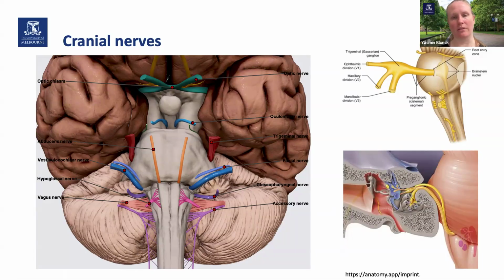And this is one of the reasons why they're actually one of the more commonly imaged cranial nerves. They are clinically quite valuable, especially when you want to understand conditions affecting facial sensation, hearing, or balance. And there is still a lot of potential to learn more about their internal structure and organization using advanced imaging. This is why we wanted to explore high-resolution diffusion MRI. We were hoping that it can give us some more detailed information about the structure of these nerve bundles.